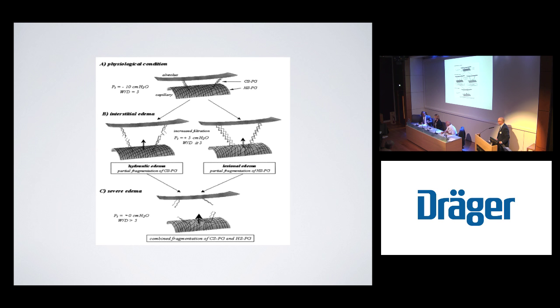I think that's also a key question, of course: the low tidal volume concept, in my view, is sometimes an incomplete thought, simply because we don't know what's happening on the other side. We don't have a good visual representation of how this is distributed. Analogous to high cardiac output, where is that going? High cardiac output doesn't mean you're going to survive your sepsis. It's how it distributes and how well your microcirculation is doing. Which was shown in that video where the 6 mLs per kg was going, and you could see on that video it was just going into a very small portion where the rest of the lung was neglected.